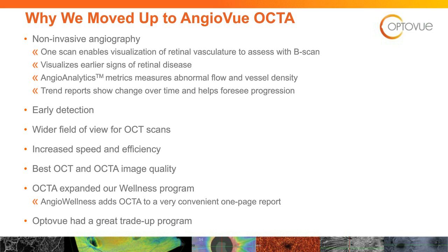Angiography brings macular degeneration right back into play, being able to find occult or see classic membranes, or to see drusen that are suspicious and see that there's really no activity going on. And more importantly, where you think things are not suspicious, being able to pick up that choroidal neovascular membrane, or that net that's either in the retina or in the choroid.